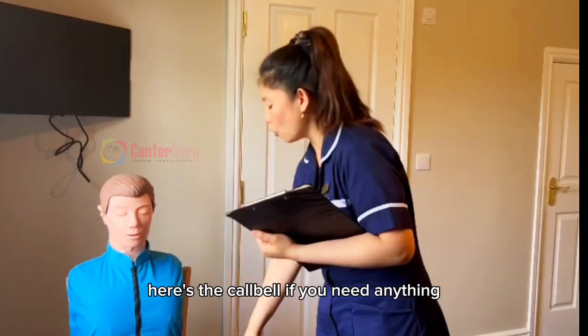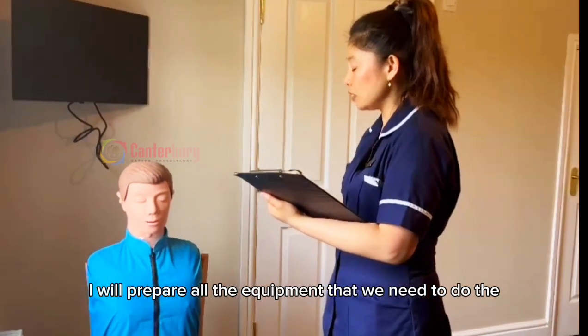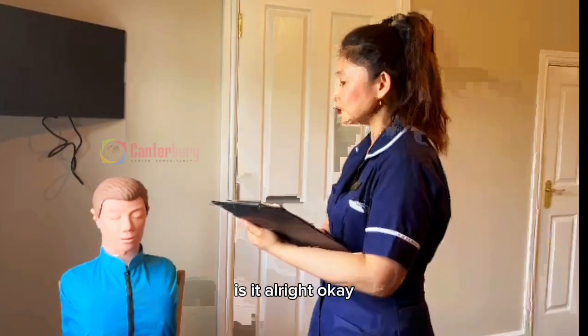Okay, now William, here I will be cleaning everything and preparing all the equipment that we need to do the blood glucose reading. I'll be back shortly. Is that all right?